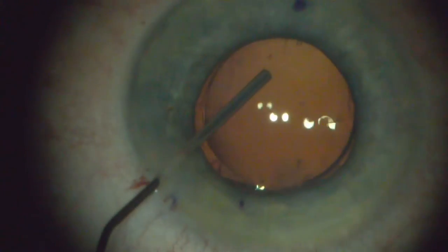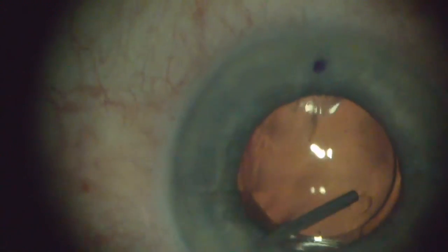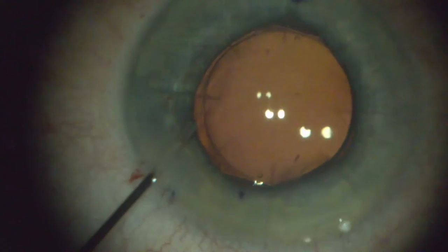This is a very elegant, accommodative lens. You want to make sure you get all the viscoelastic out so it positions itself in the appropriate place for good healing and good outcomes. I hope you enjoyed this video, and I hope you enjoy learning more about ophthalmology. Thank you for your time.